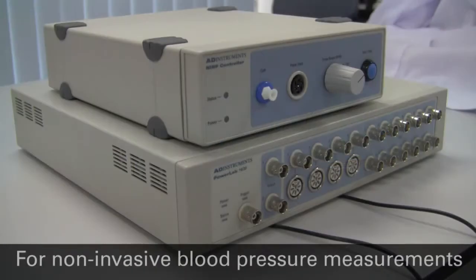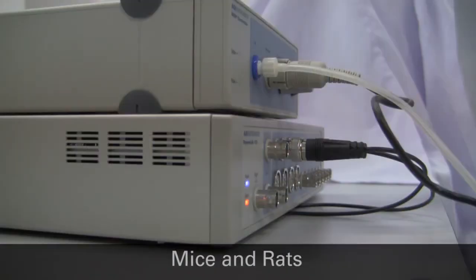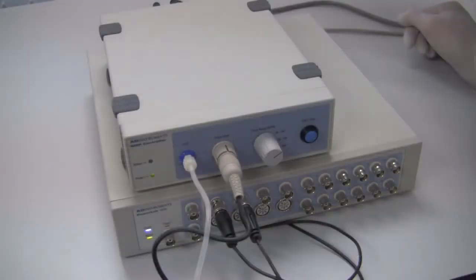The ML125 NIBP system performs non-invasive blood pressure measurements on mice and rats using specialised tail cuffs. The system provides a good estimate of actual systolic pressure, whereas diastolic pressure can be derived in LabChart, but is a less reliable measurement.